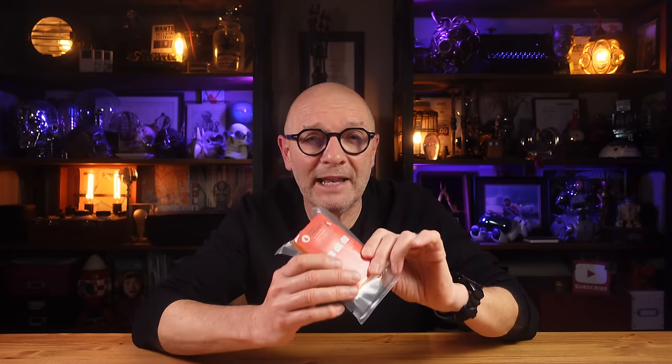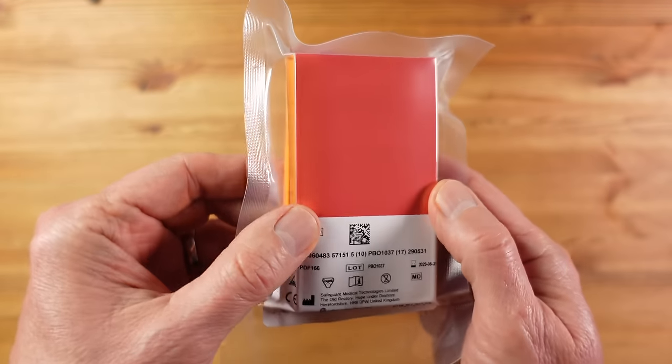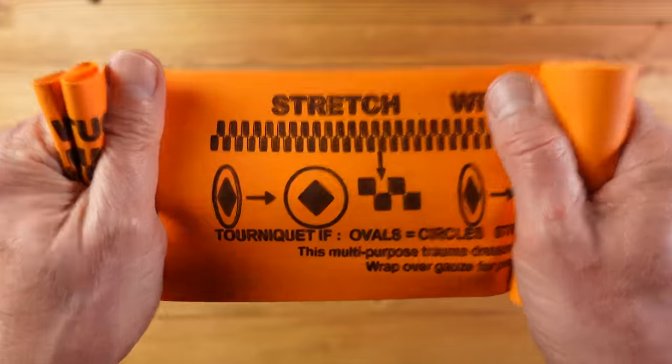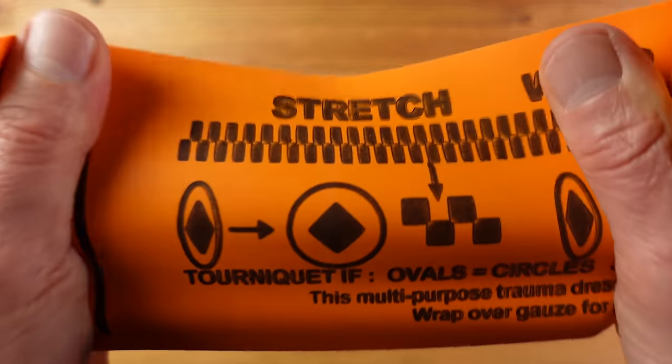I also wanted to explore another more compact tourniquet option — this is the SWAT-T tourniquet. This is how it comes when it's vacuum packed to minimize bulk, and when it's out of the packaging it looks like this. It's made from a non-latex elastomer, and the printing on it is designed to ensure it's easy to use and that you apply the right amount of pressure to shut off the blood supply.